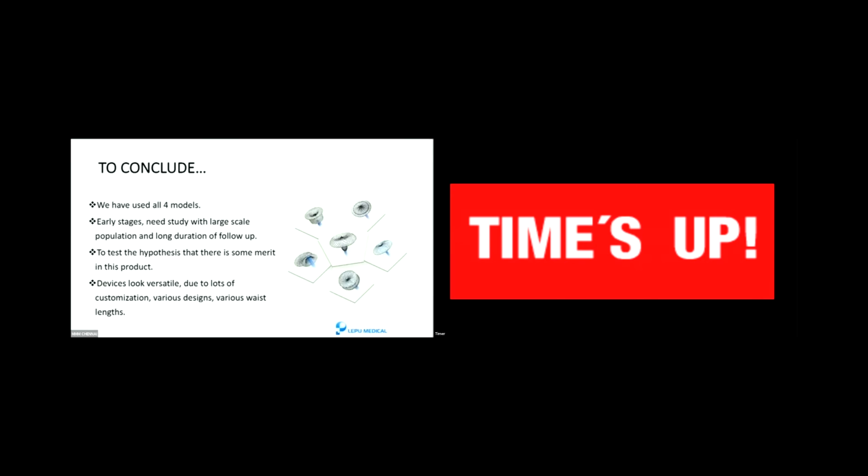So whether we are really going into the customization of VSD devices in the future is still to be answered, and multiple studies and a large scale study are essential to conclude the hypothesis.